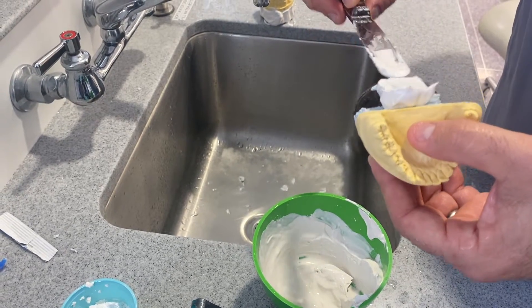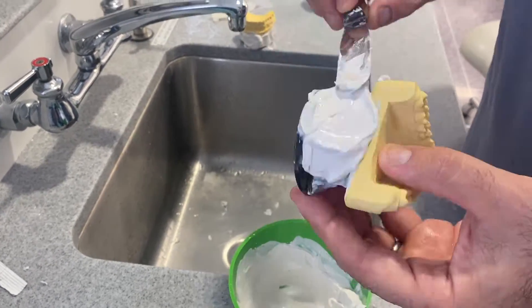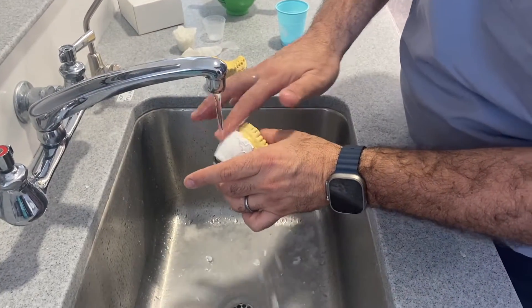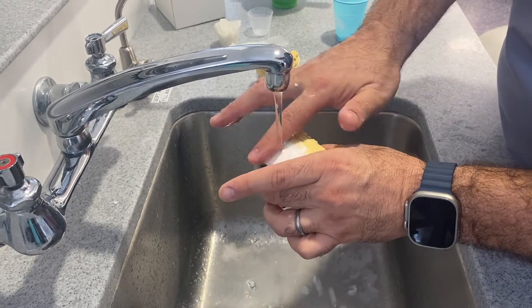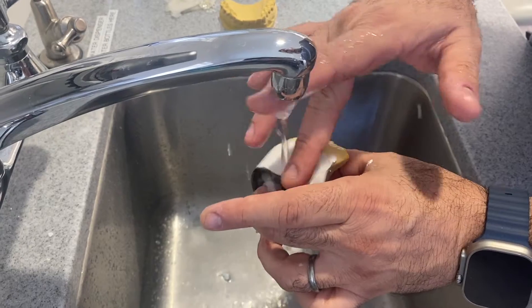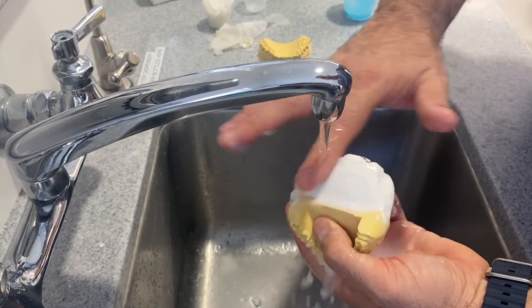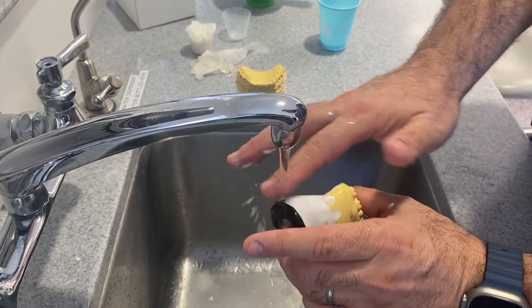I recommend that if this is the first time you're doing it, do one and then wait and do the other one. Under runny water is one way. I'm going to show you under running water because it's easier. Just rub it with your finger, making sure the mounting plate is completely free of material. Just turn it and keep cleaning.